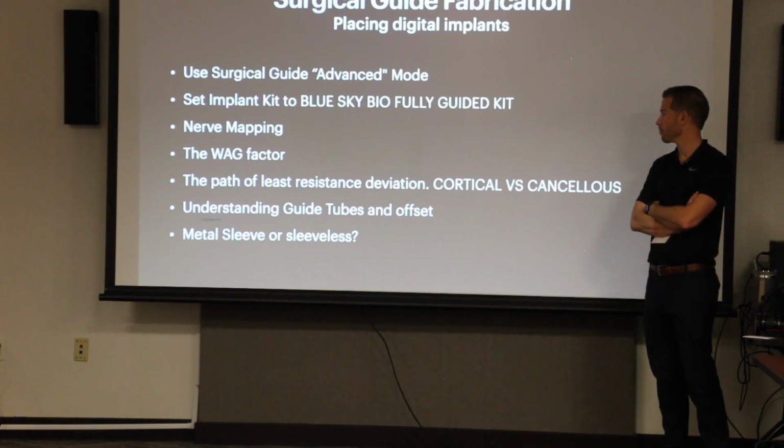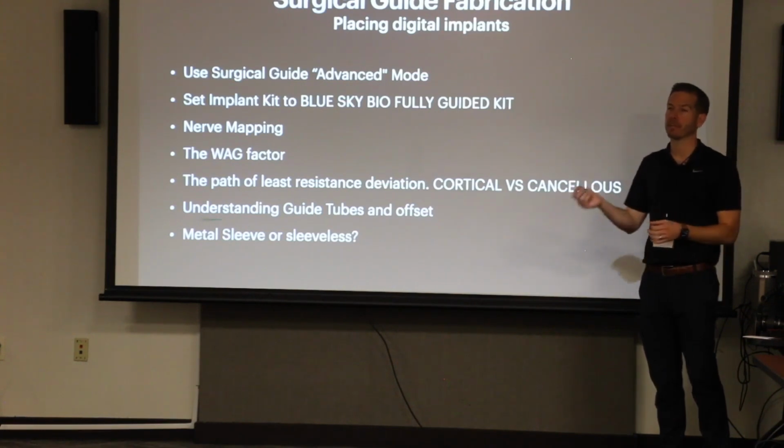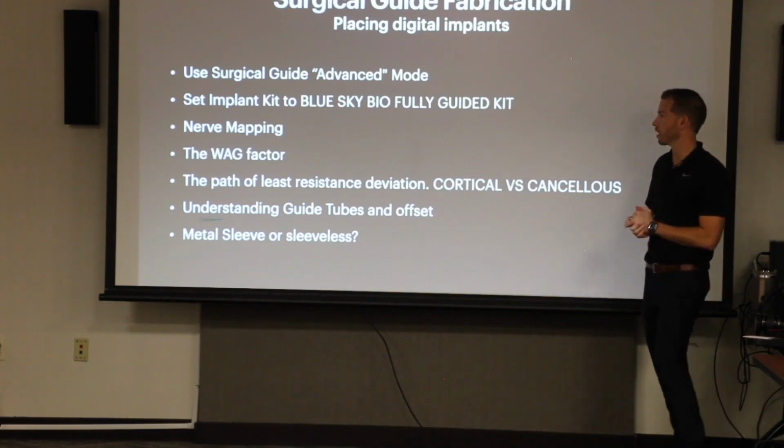But just going standard surgically, we haven't really had too many issues with overheating, because they're in there for so little time. You're engaging it without it spinning, so that decreases friction. It's spinning inside the guide for 2 or 3 seconds, and then you're done. That's where the multiple drills come into play. It should be 1-2 seconds, and then you're putting that drill back in the cassette and grabbing a new drill. So I can't imagine heating being a significant issue.